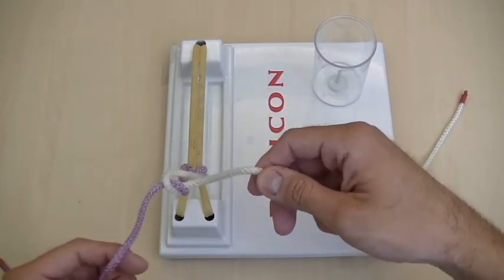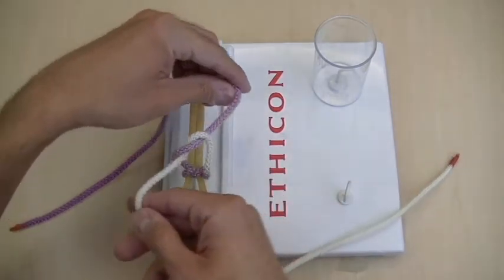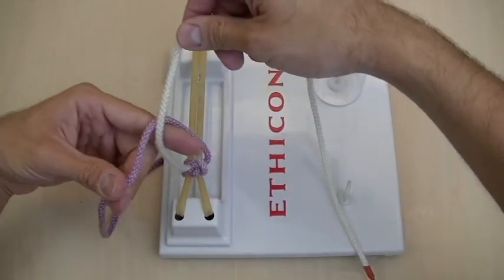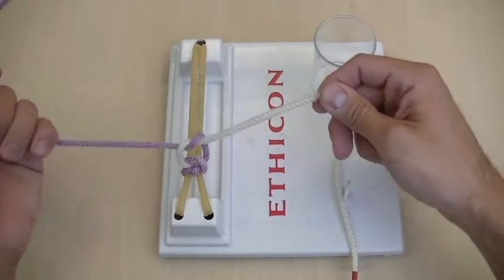Since that was an underhand, which is like a thumb on the two-handed throw, it's thumbs up. So now you're going to bring this hand up, then all the way over to complete your square knot. And then you're going to do an overhand again, where you go like this, bring the white string under, loop over, and bring the purple string down, and tie down.